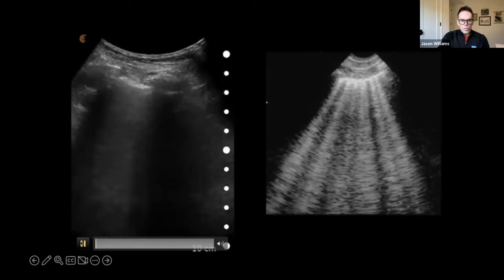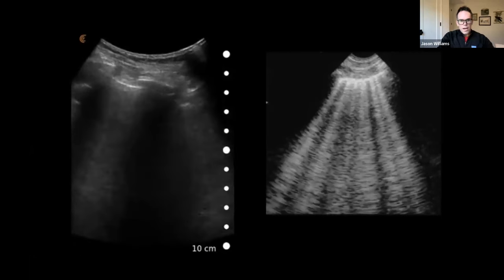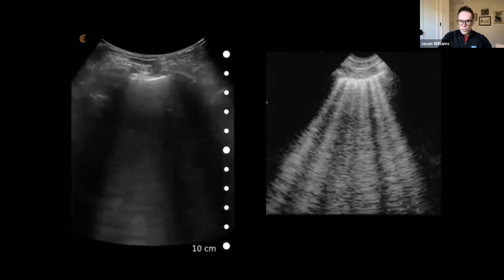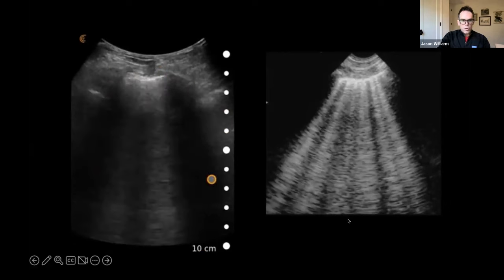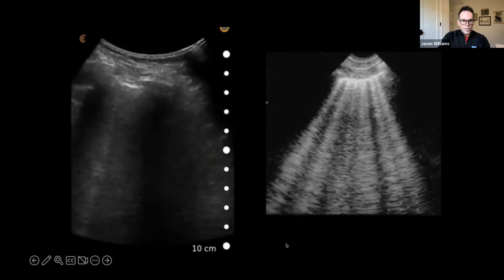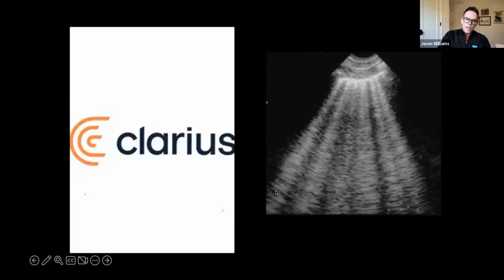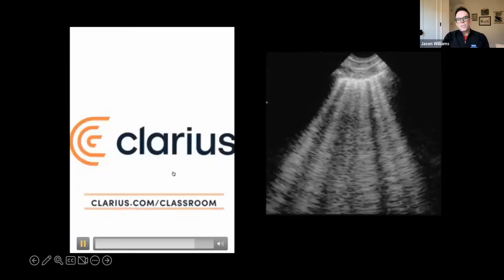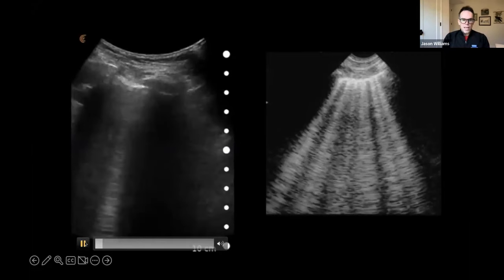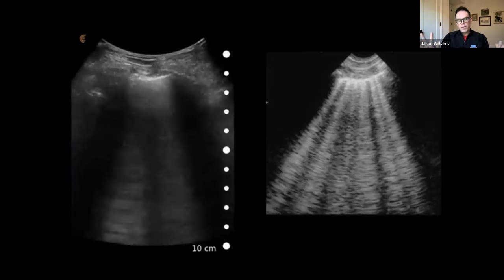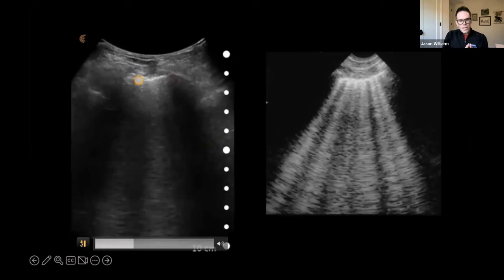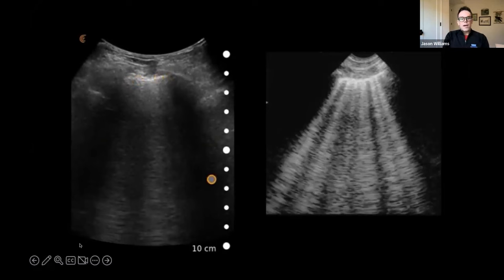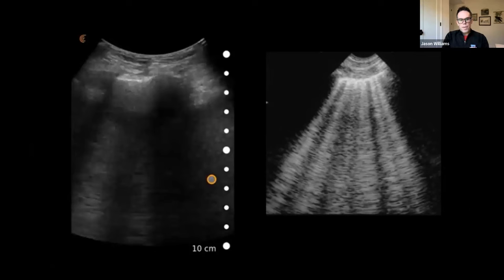Sure. So where that orange cursor was just a second ago, you have that bright white line as the pleural line. And then coming down from that are these kinds of vertical spotlights that are moving back and forth. They kind of get wider as you get to the bottom. And you see them kind of a little more clear on the image on the right, all those vertical spotlights coming down. And that happens when you have some type of infiltrate in the lung itself. Normally air is the enemy of ultrasound. And so when your ultrasound waves go into the lung, they're lost forever. 85% of those ultrasound waves just bounce around and never come back to the probe. But once you start putting something in the interstitium of the lung between the alveoli and you thicken that interstitium, then you can conduct these sound waves, these vertical spotlights into the lung. And you actually see those reflections come back to you.